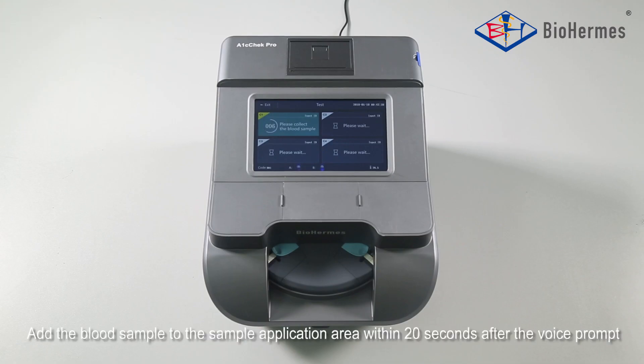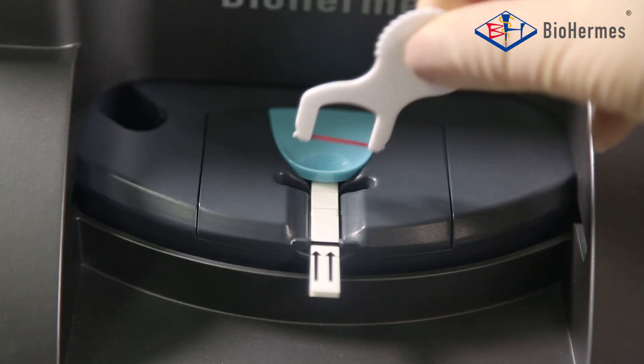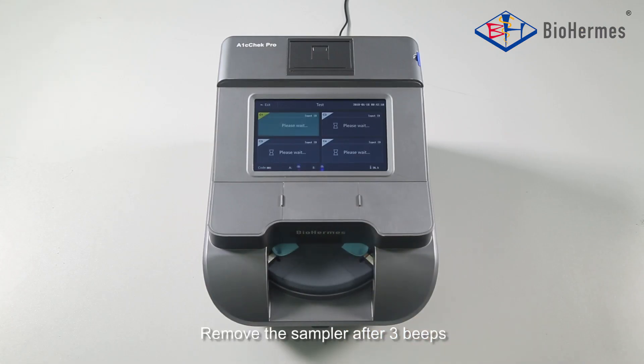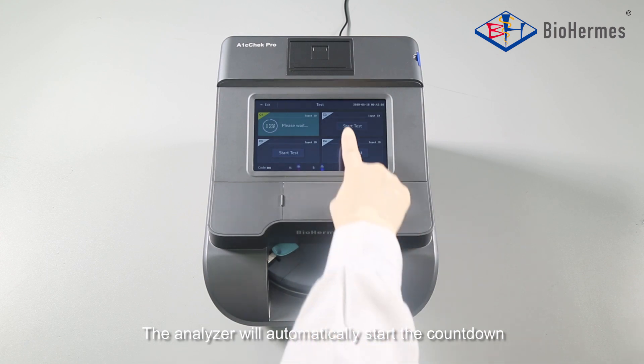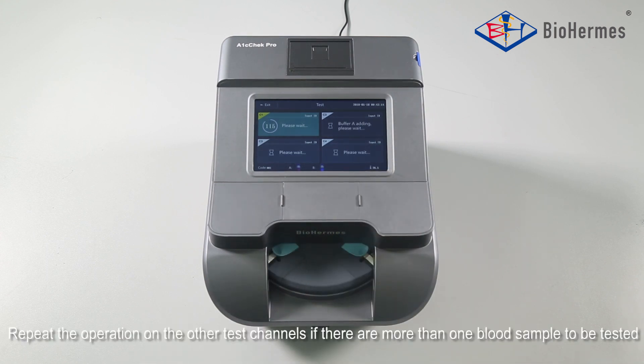Blood Adding: Add the blood sample to the sample application area within 20 seconds after the voice prompt to apply the blood sample. Remove the sampler after 3 beeps. The analyzer will automatically start the countdown. Repeat the operation on the other test channels if there are more than one blood sample to be tested.